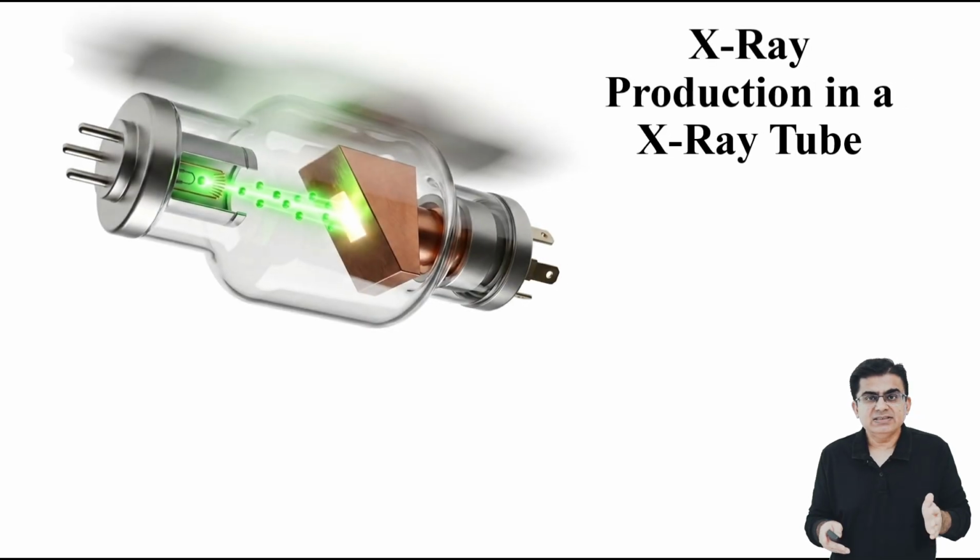So guys, this brings us to the final and closing slide of today's presentation. We have just seen the X-ray tube in detail. We saw the generation of electrons at the heated cathode. We saw their acceleration across the vacuum. And we analyzed their deceleration upon striking the heavy tungsten target.